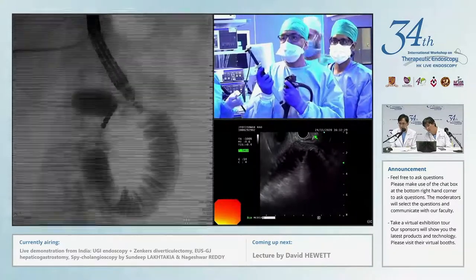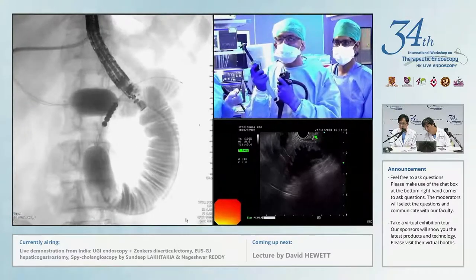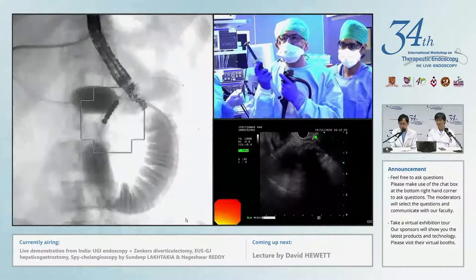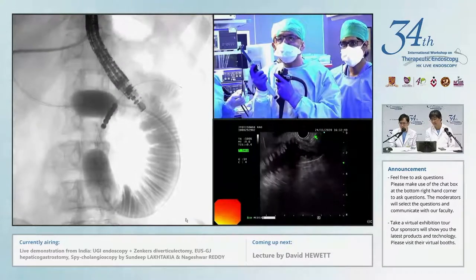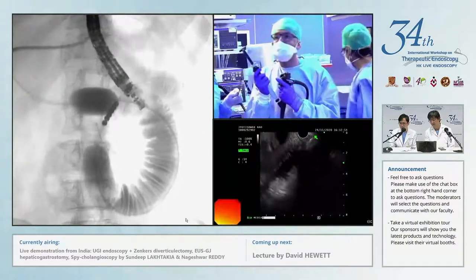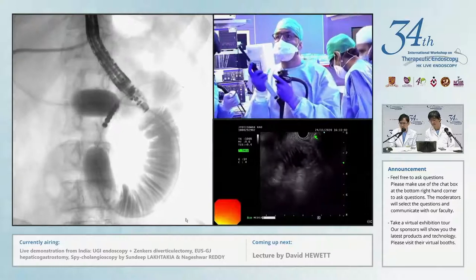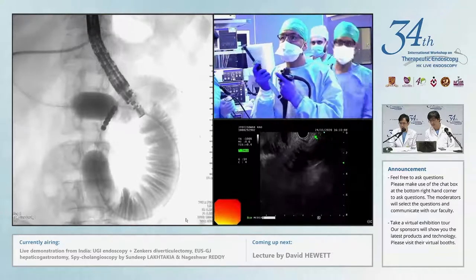I'm just trying to paralyze. Dr. Pinder has agreed to give a little bit of Buscopan. I'm just waiting for that window of opportunity when I have the best distension with not much peristalsis. But this looks okay. Some connection issue? It didn't burn. I tried my first go. Connection's okay? Okay. That sound came.